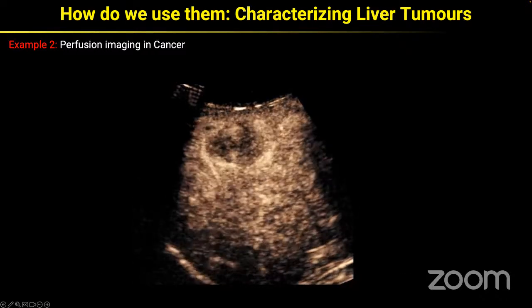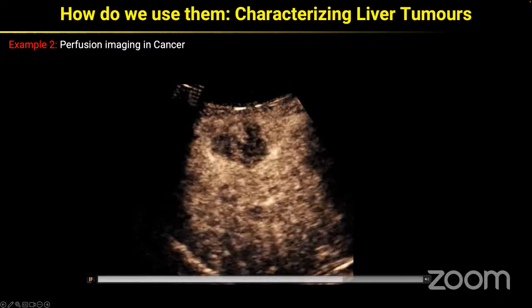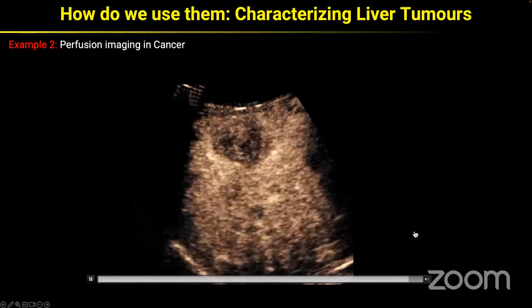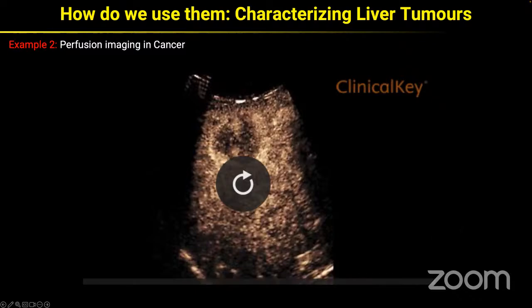And then this gives us, I think, our best example of this enhanced washout. So again, you can see here, if this is the center of the tumor, all of a sudden, all of the contrast kind of just leaves. And we see this enhanced washout with this rim enhancement, which is really characteristic of liver metastases. So it's a really interesting way that we can use real-time perfusion imaging to start to characterize liver cancers.